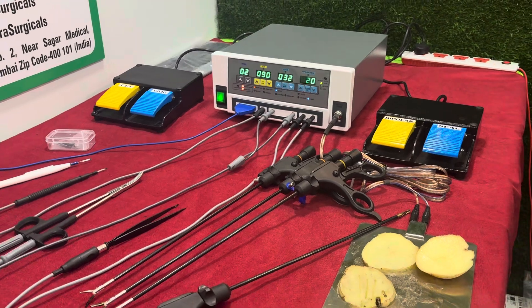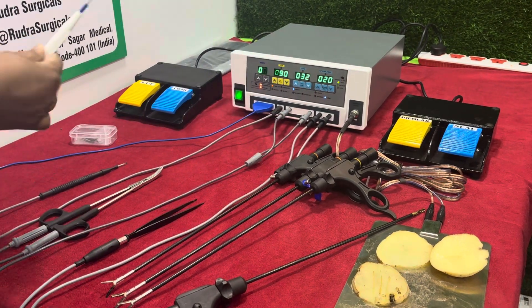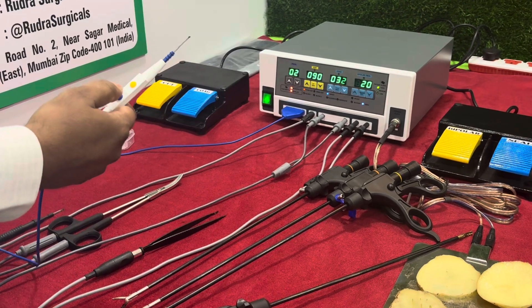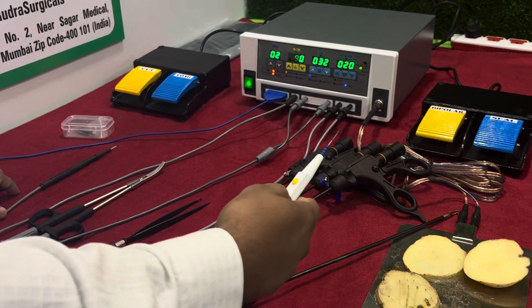All these cables you have to connect line-wise. First you have to connect this hand control quadri pencil. This is a two-in-one quadri pencil and can be used with hand as well as foot also. It is used for cutting and coagulation.